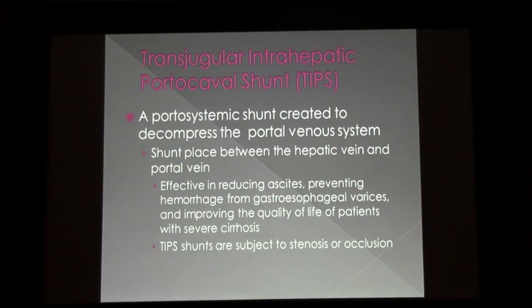So, even though TIPS are a way of correcting the portal hypertension, they are subject to stenosis or occlusion.